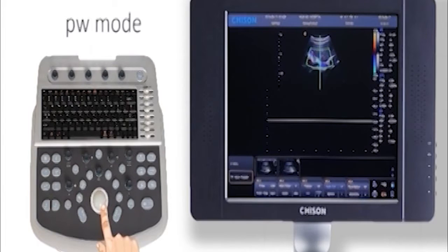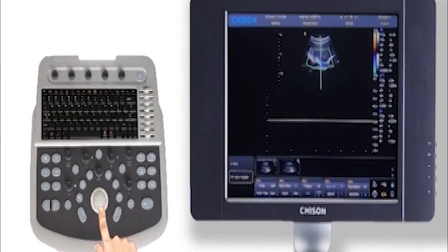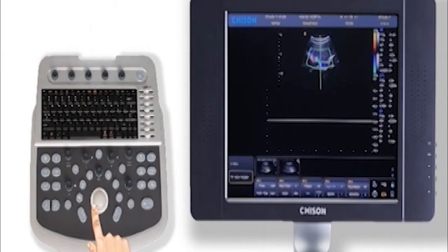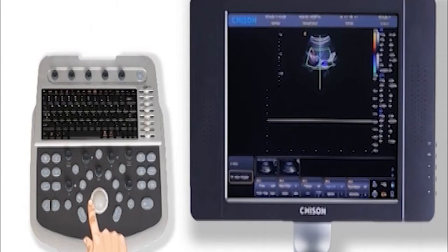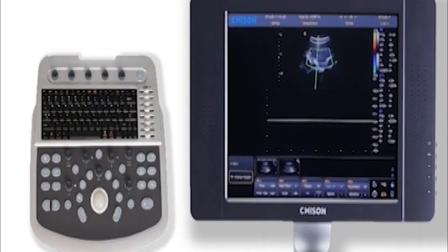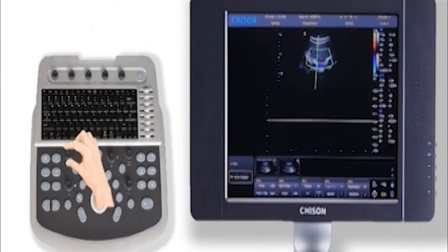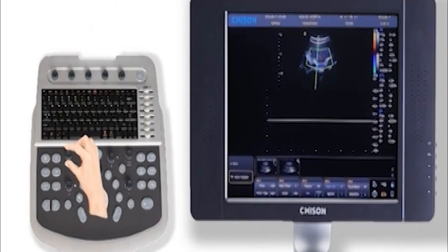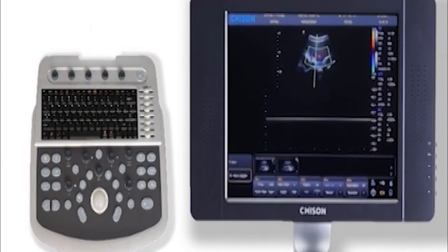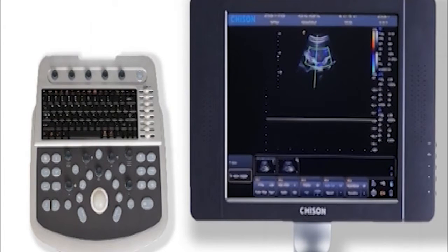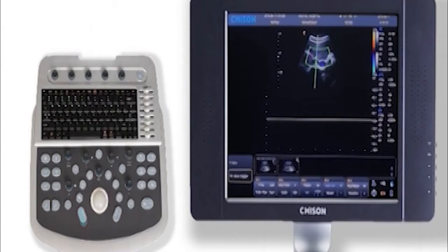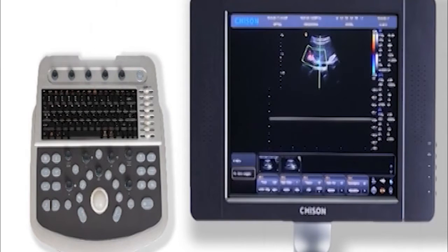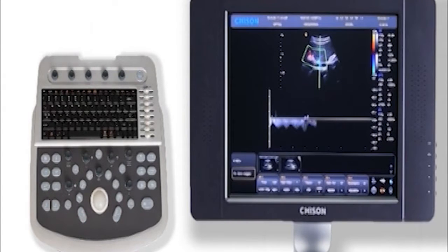Rotate the angle key to change Doppler angle. Press the update key to activate Doppler angle.